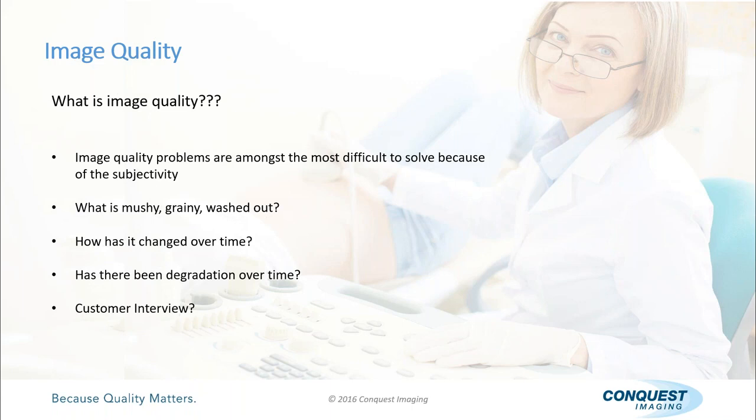Whether you send them to PACS as a point of reference or you have a physical printout of them, you should capture these images, because 3 months later, maybe the technologist is trying to describe a problem to you, and it's not a tangible artifact. A tangible artifact's easy. It's a big line going through your image. Well, it's missing data. It's not there. That's easy to see. But when they start talking about mushy, washed out, grainy, all the other subtle things, you can simply bring your phantom back out, do another set of images and compare them to the last set and see if you've seen a degradation over time.